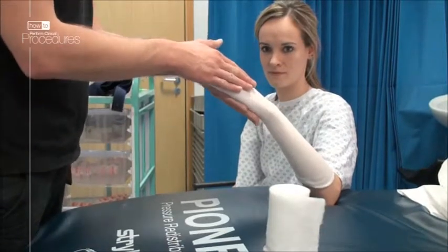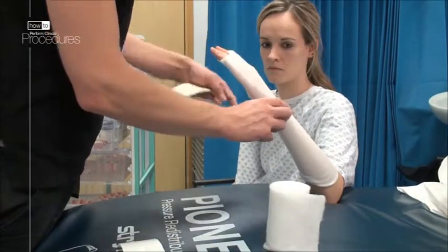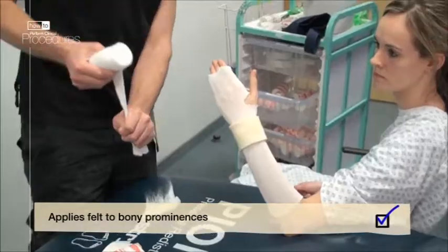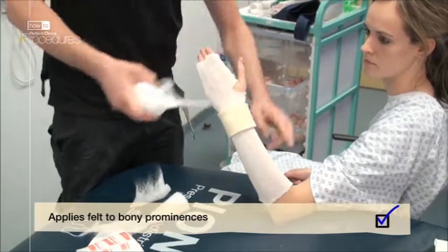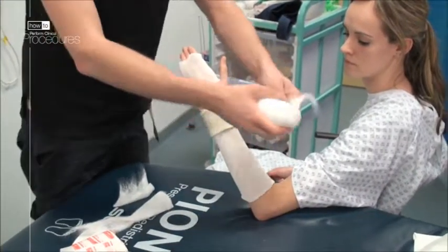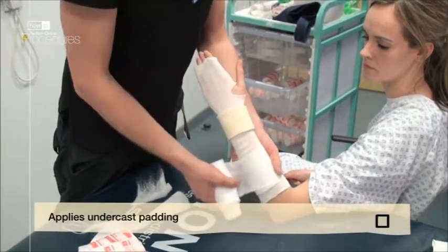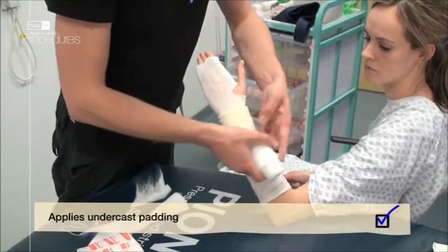You may wish to pad out any bony prominences with some felt, as seen here over the ulnar styloid. This just optimizes comfort. Starting two fingers' breadth distal to the elbow crease, apply the undercast padding with 50% overlap as you progress, effectively creating two layers.